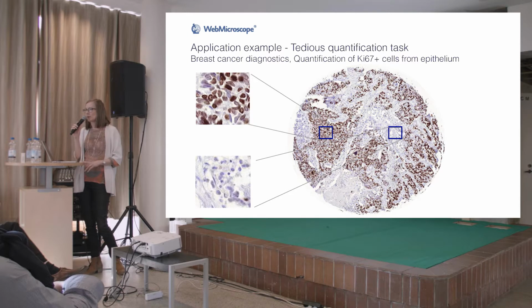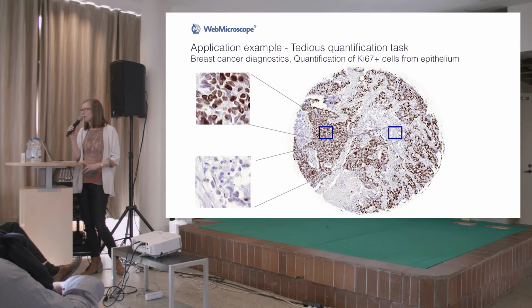So here we started with selecting, for example, a good image set for the training part. And here, of course, it's important to verify that the training set of images represents very well the actual samples being analyzed later on. And once the training set is selected, then we start annotating them.